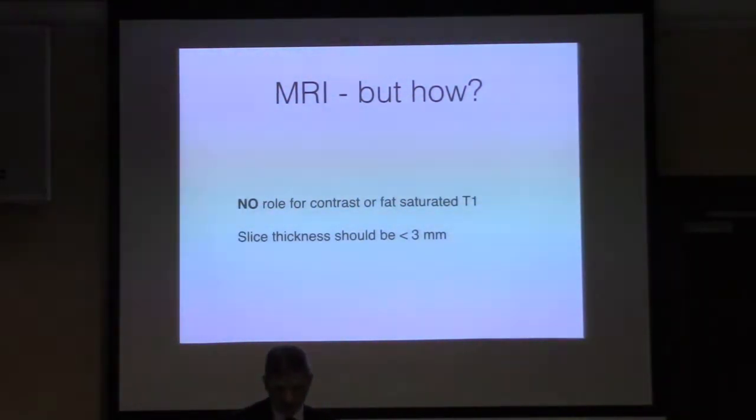Slice thickness should really be no thicker than 3 millimetres. Anything bigger than that and a wider interspace will diminish your ability to identify subtle disease. That may make a very big difference to the treatment plan for that patient.